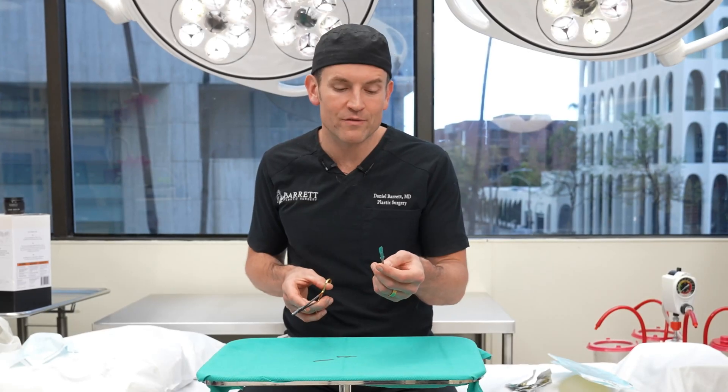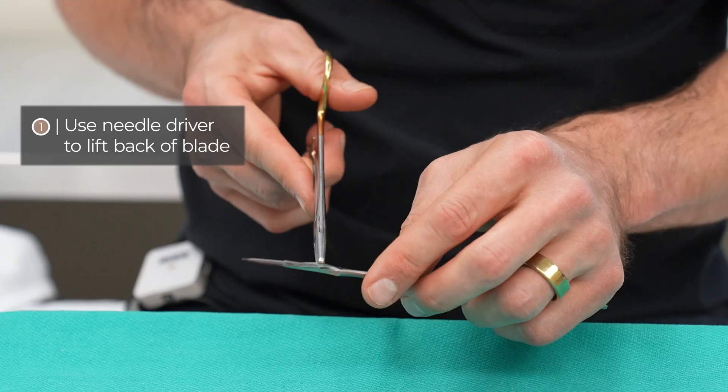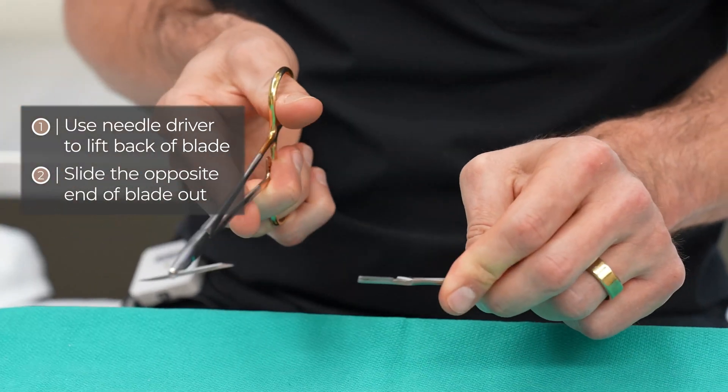A safe way to remove the blade once you have it on there is to just take a needle driver or a snap and basically lift up the back portion and slide it off like that.